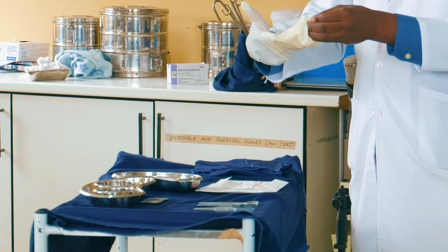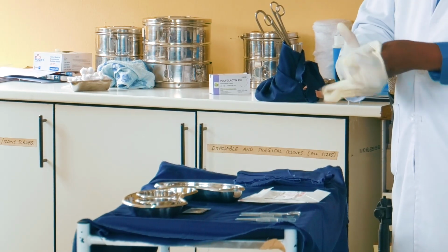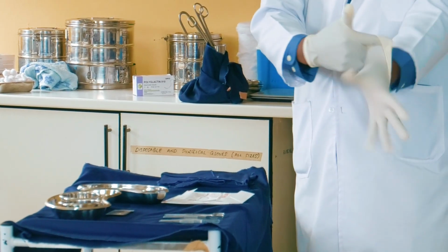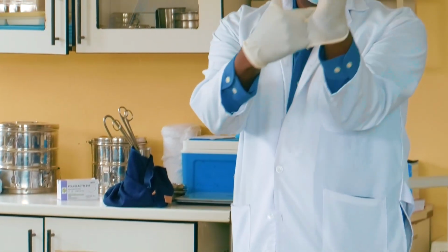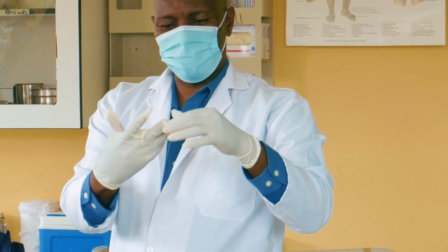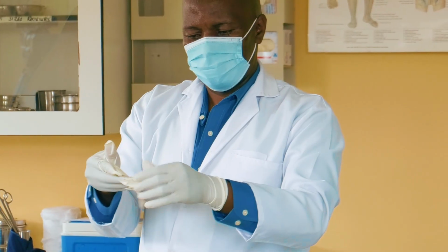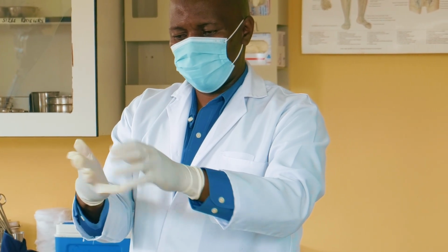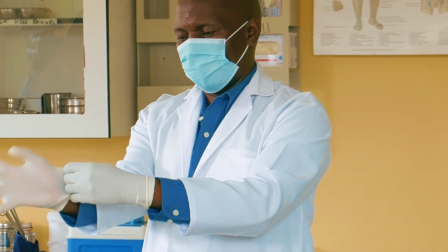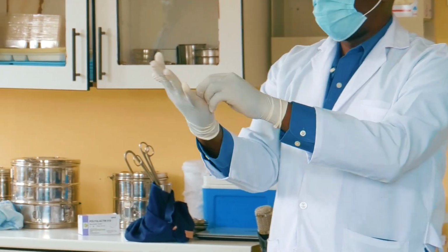Even during your school, you do the same? Yes. This is the first time you'll be using the sterile gloves, but you know how to do it. Then now, since this one is okay, I'll sort out these. I'll tell them one for one. I can correct this situation, so don't panic. Some people have cried. Now two fingers are falling in one. We'll be watching you.